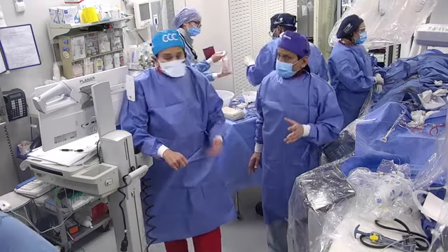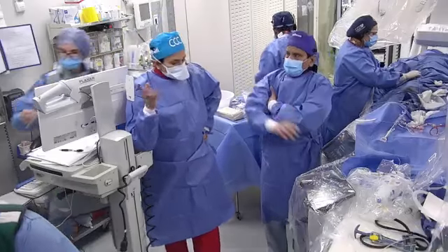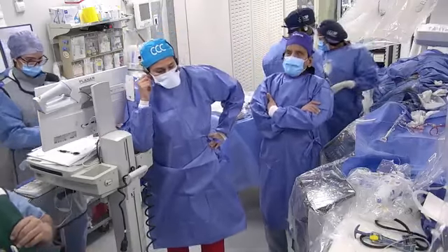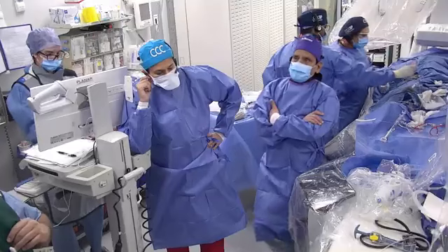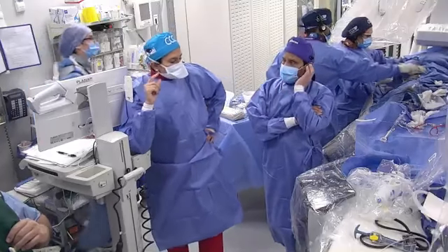A lot of predicted questions. Then one question was the use of laser in ISR. Did you answer that? No, we said that for unexpanded stent, as we said earlier, laser is good. In ISR also it is good. There are some trials in the past that have shown that laser does work in ISR, more so in unexpanded stents. But unexpanded stent is not always the case.